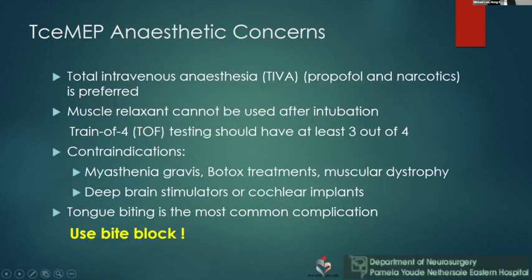And as I've said before, we use total intravenous anesthesia, and we cannot use muscle relaxant after we intubate. During intubation, of course, you can have some short-acting muscle relaxant. And how do we know that the muscle relaxant effect has gone? We use this train of four testing. So we give four stimulations. If we have at least three, then we are certain that the muscle relaxant effect has gone.